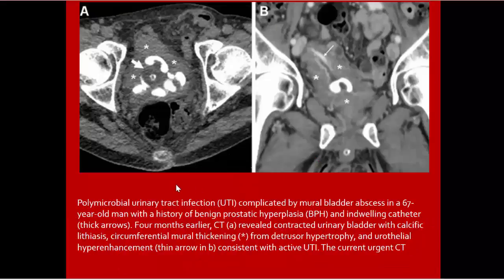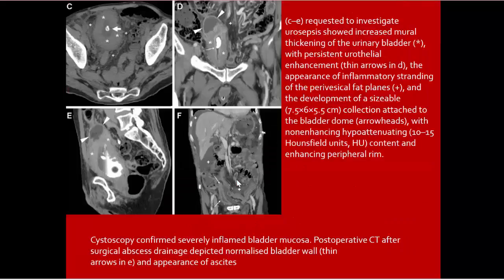Mural bladder abscess. Circumferential mural thickening from detrusor muscle hypertrophy with urothelial hyper-enhancement. Investigation reveals thickening of the urinary bladder wall, persistent urinary tract infection, urothelial enhancement, inflammatory stranding, and fat stranding in perivesical fat planes. A sizable collection attached to the bladder dome with non-enhancing hypo-attenuating Hounsfield units, contained within an enhancing peripheral rim, resulting in abscess formation.